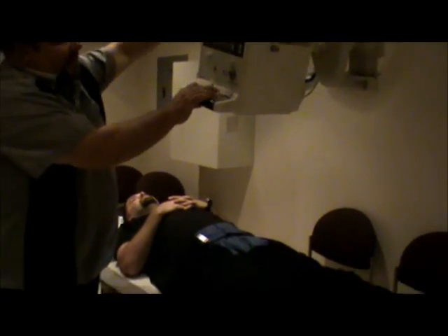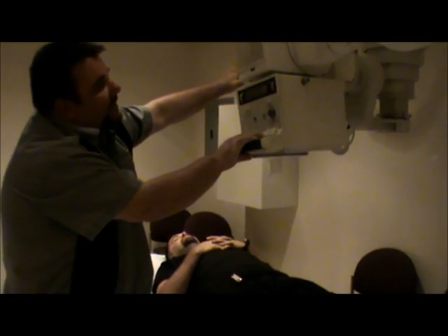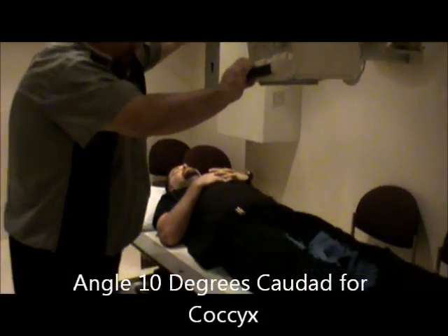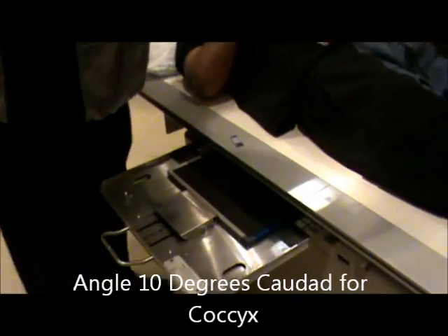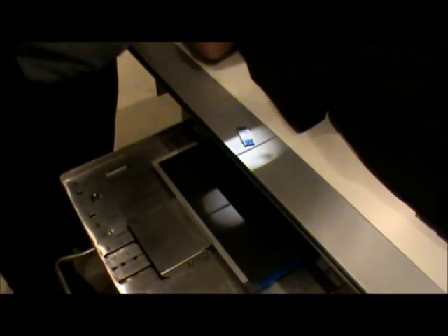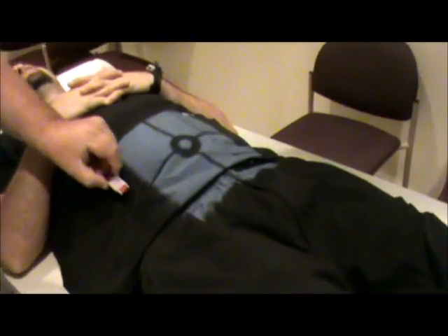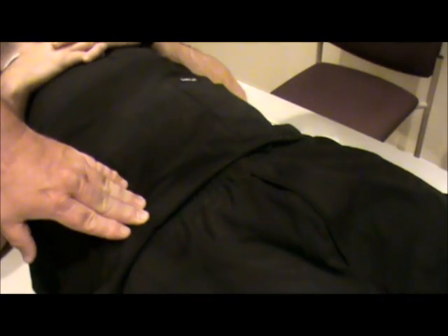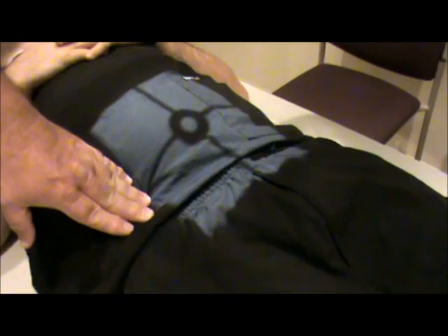We'll change films. We are going to angle the tube now 10 degrees caudad, and then recenter to our film, making sure that we are still center locked. Now the centering is very similar — it's actually the same. You're going to palpate the ASIS. Bontrager tells you to come two inches up from the symphysis.